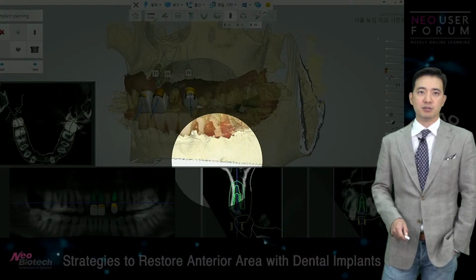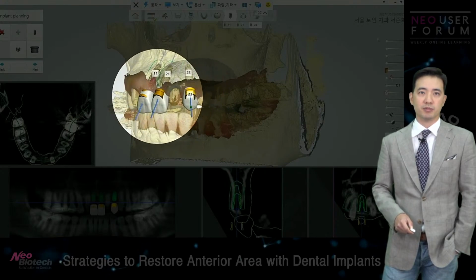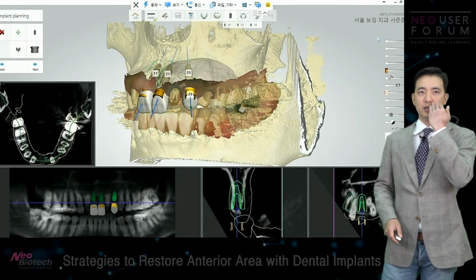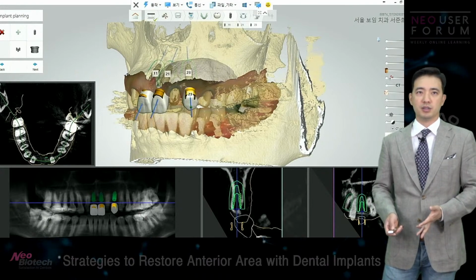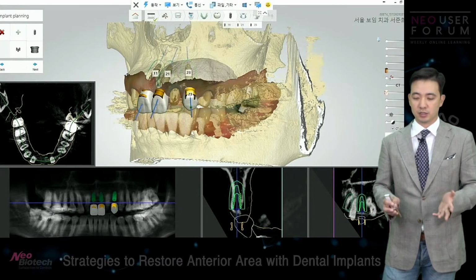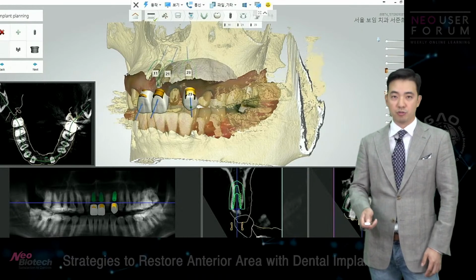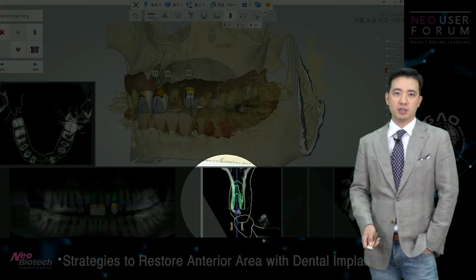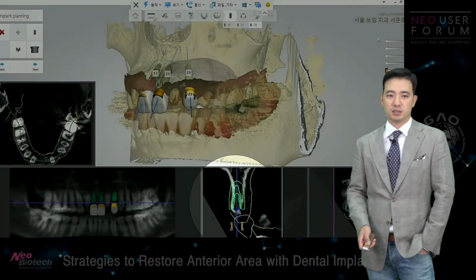So as a result, see where the screw hole is coming out, because the patient's maxilla is like this. There's no way around. When I first sent my scan, the technician naturally thought that there's no room for the implant to go in, so I'm just gonna put the implant in the middle of the bone, and that's so much we can do.